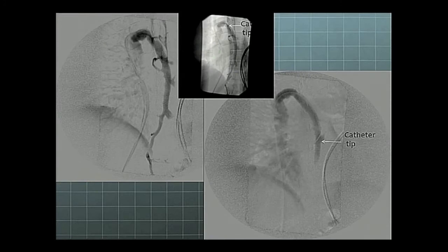I'll just show you some examples of abnormalities in the azygous. Here's one in the arch associated with reflux. You can see filling of vessels. We dilated this, and here's the tip of my catheter. Actually, the tip of the catheter was up here, and my tip here is even a little bit further in, so if anything, that should promote reflux, the filling of collaterals, but it's actually less.